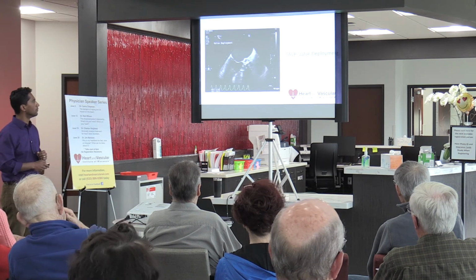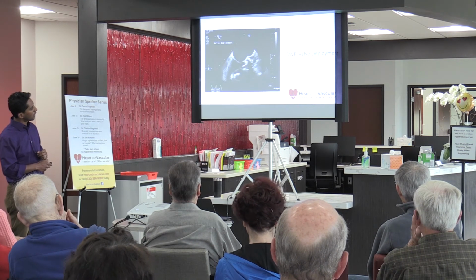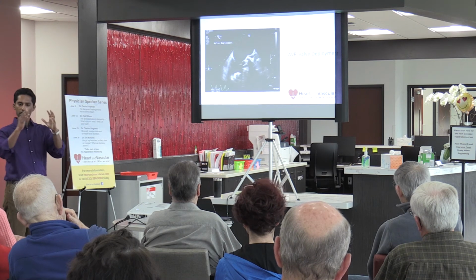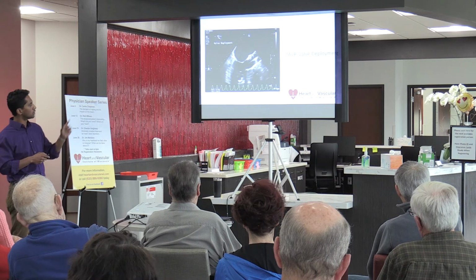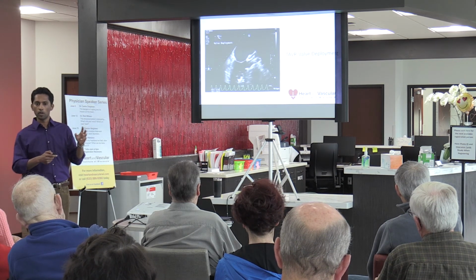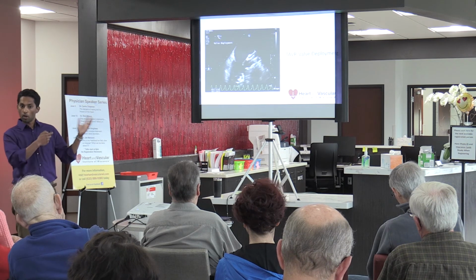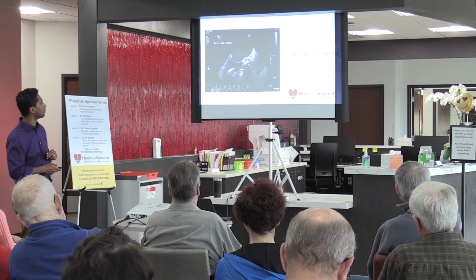So this is an echo image of what that same process looks like. What you're seeing here, you'll see it over again. You basically start seeing it very narrow, and then right there you see a balloon expanding it, crushing the old valve out of the way. So this is just a different view of the same thing. But during procedures, when we used to do a lot of transesophageal echo, which is what this is, we would routinely monitor this process where we would watch it on echo as well as on x-ray. That's what that process looks like by echo.